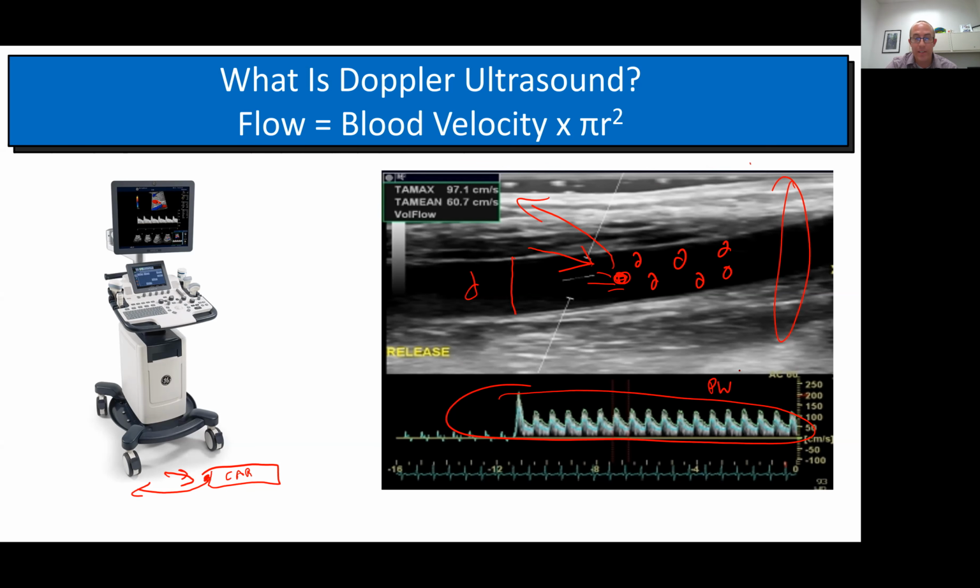And what's cool is you can see it at rest, you'll be able to see how this blood flow is influenced by heart rate. So here's an EKG tracing down here. And every time you see a spike, that's an R wave, that represents the heart contracting. We're measuring this in the arm actually. So a spike represents the heart contracting, and a couple of milliseconds later, a pulse of blood makes it to the arm.